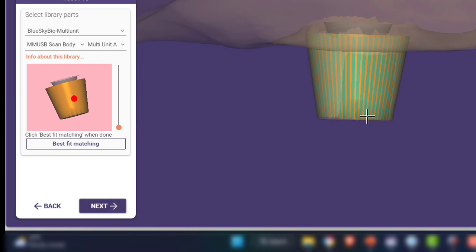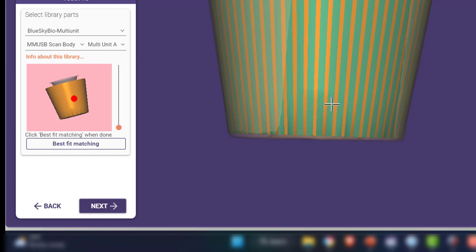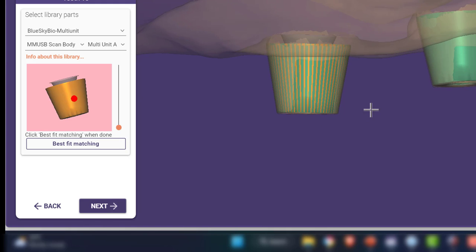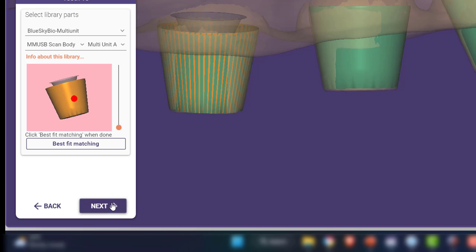And if you were relying on just the stitching software to do this, there might be some discrepancies, but literally the output from the Grammee scanner, the mesh is one and the same as what's in this Blue Sky multi-unit library. So there's no way that stitch can be off, and you're going to see this. It's going to be completely interdigitated. The mesh triangles are the exact same in both of them. So it's a dead-on stitch. You're not losing any accuracy by doing this route. All right, click next.